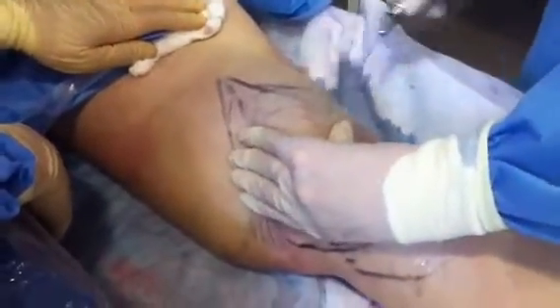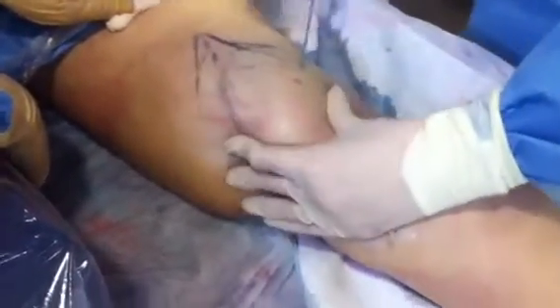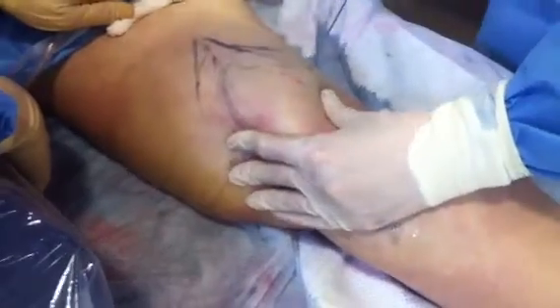We've numbed the patient. She doesn't have any sort of general anesthesia or IV anesthesia. She's just had some local numbing called tumescent liposuction.